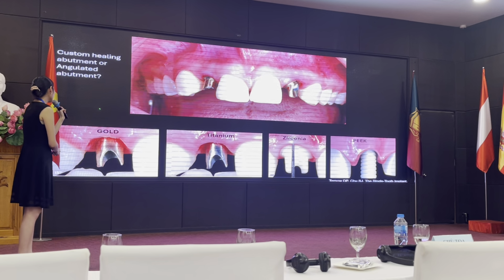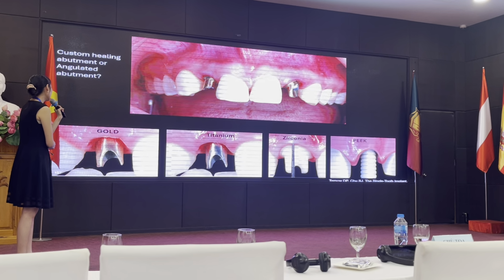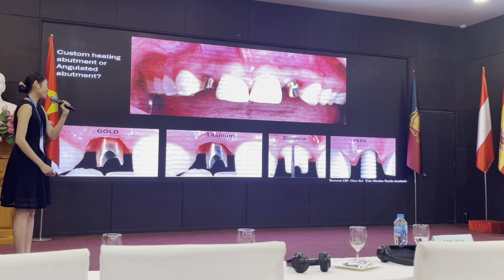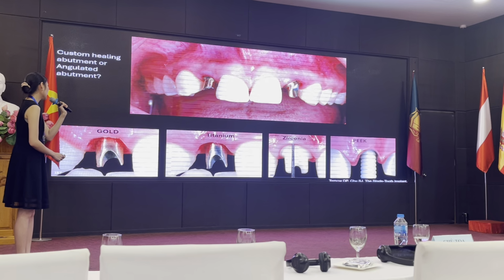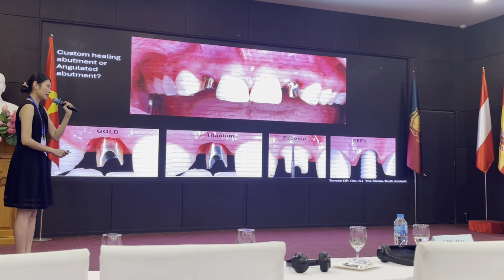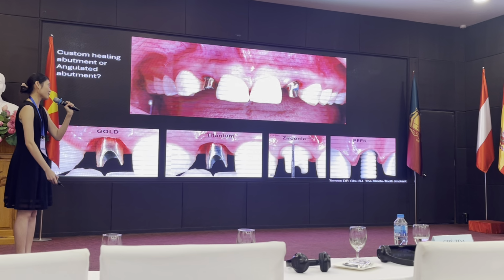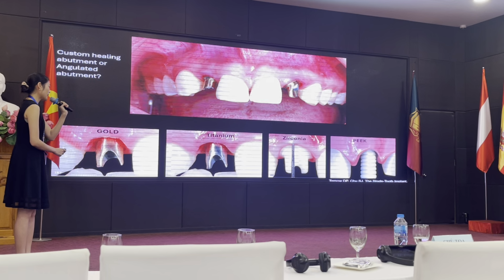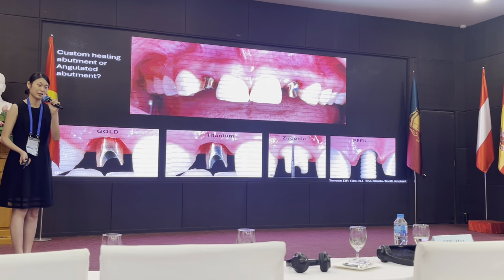So between selection for custom healing abutment and angulated abutment, how do I select? For anterior case, I would like to know how deep the margin is going to be. If that's the case, I prefer custom healing abutment whenever possible. And in this case, you can appreciate we are going to have a cement-retained restoration.